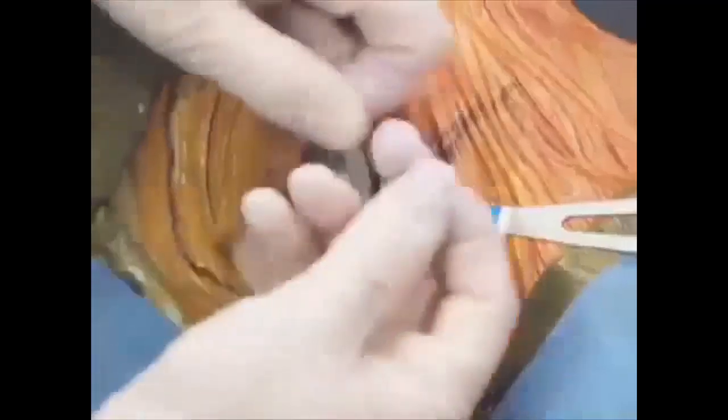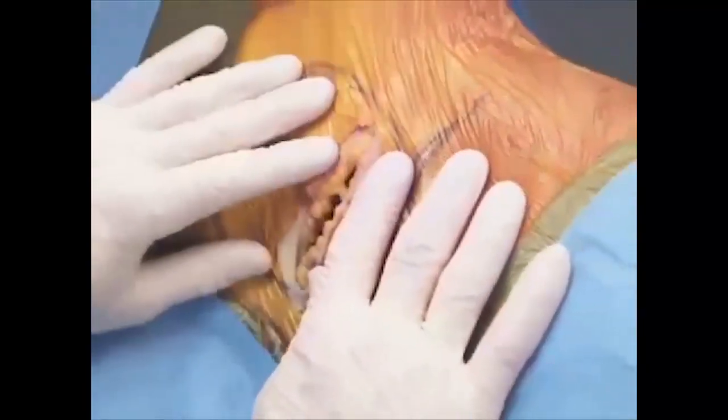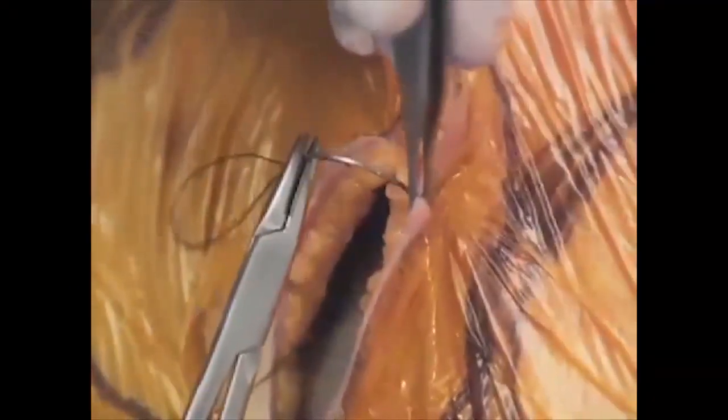Place 2 more sutures in the fascia. Pull each one through a suture loop on the pump. Tie the sutures, securing the pump in the pocket. After the pump has been placed in the pocket, close all incisions using subcutaneous and skin sutures. Make sure that no sutures are placed directly over the reservoir fill port or the catheter access port. Apply appropriate dressings.